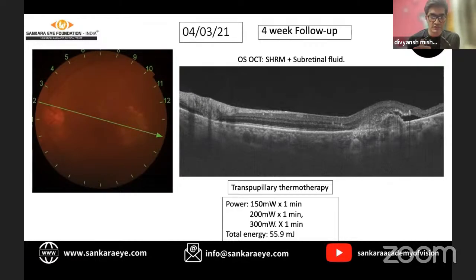And as you're seeing, gradually the power is increased. So you don't go suddenly to 300, because you don't know that if you start doing the laser, you would start seeing a dense white scar. And once you see that scar, that means there is no point of return. So that's why you gradually keep increasing the duration and the power, and that's how you achieve the treatment.